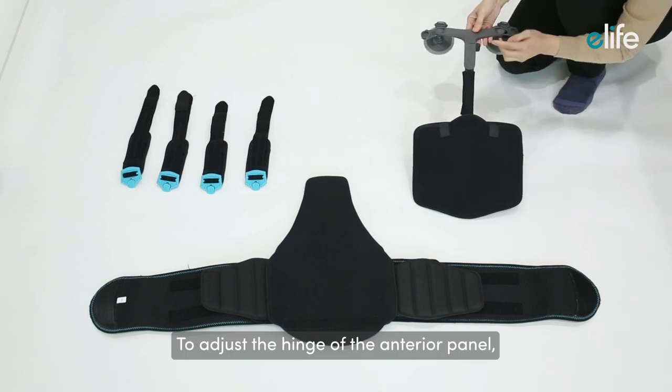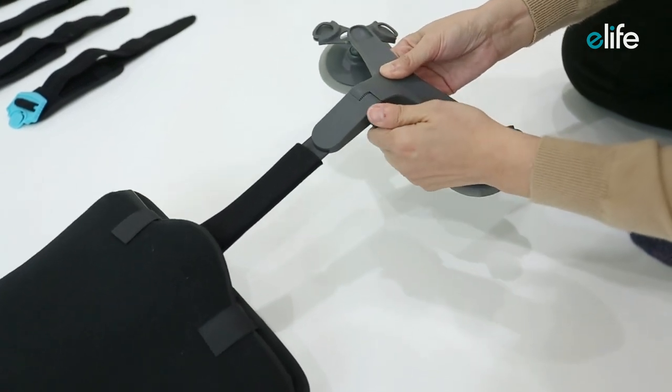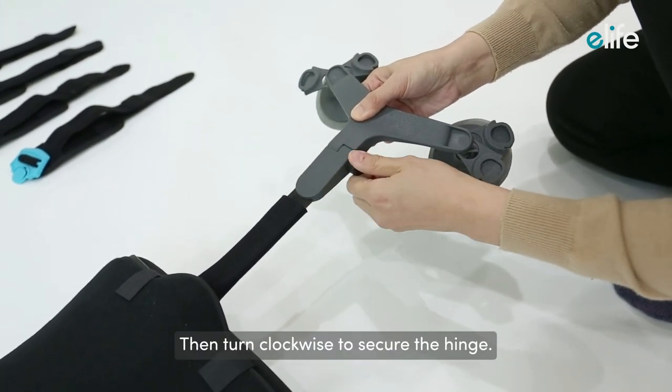To adjust the hinge of the anterior panel, press the side button and turn counterclockwise, then turn clockwise to secure the hinge.